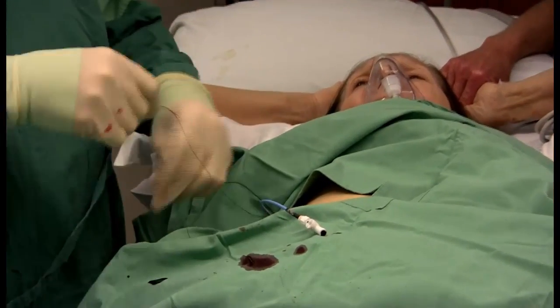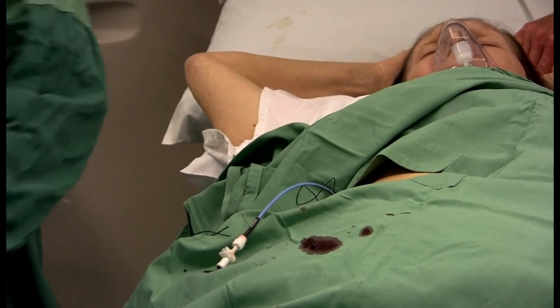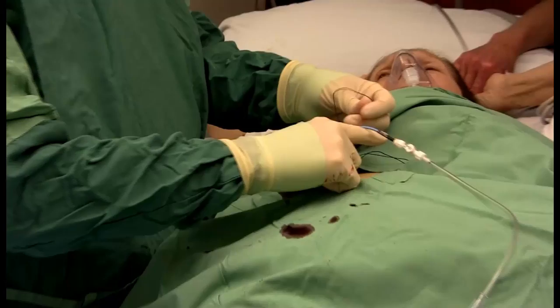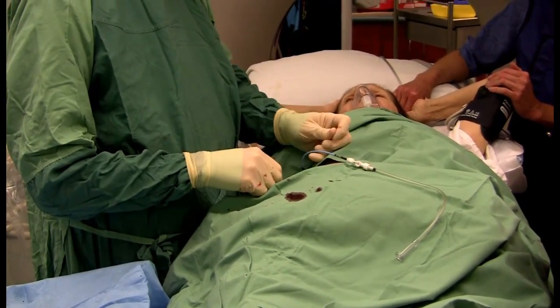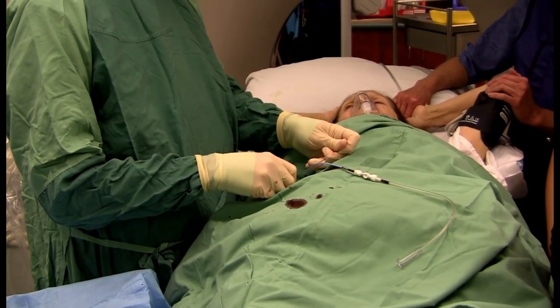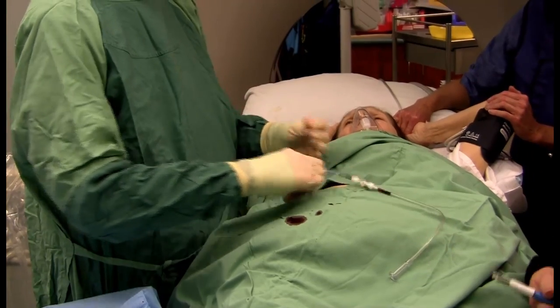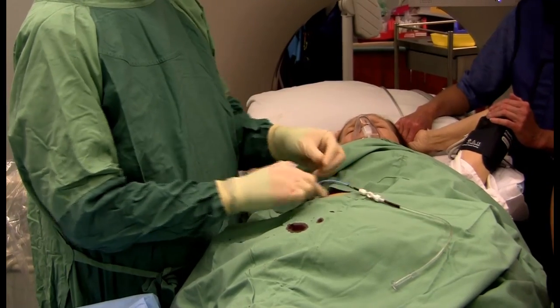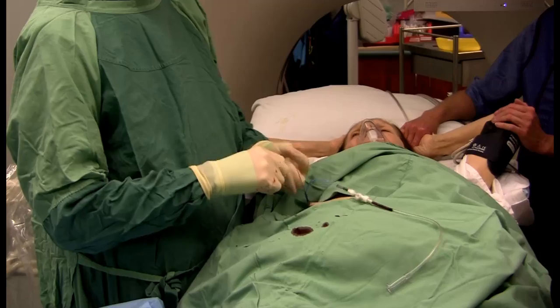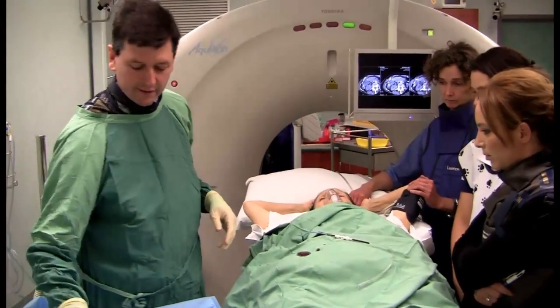Then we do a so-called Roman sandal tie — a series of passes. We throw the threads behind the drain, bring them back out on top, do a half-turn, and snug that up fairly tight: not so tight it occludes the drain, but not so loose that it'll slip. We do that several times — maybe half a dozen or so of those little bites spanning about a centimetre of drain. At the end of that, we just tie off with a series of simple hand ties to lock it off, grab the blade, and cut the thread.